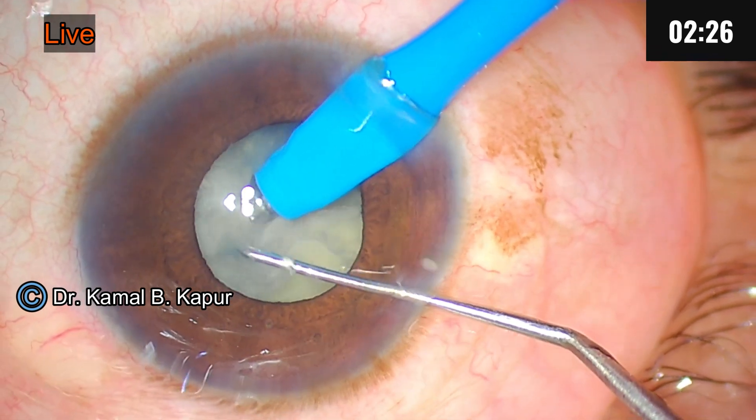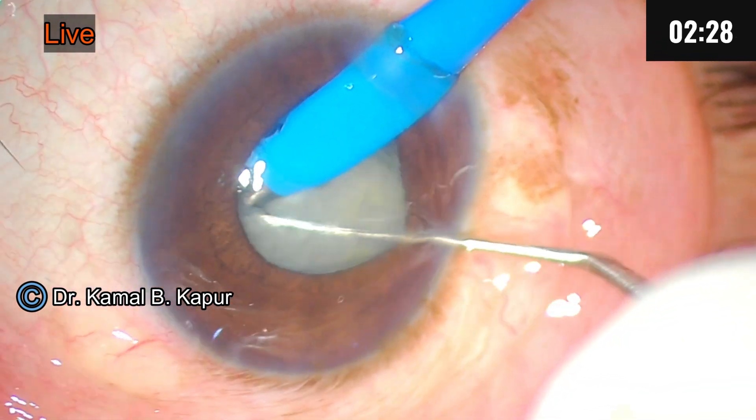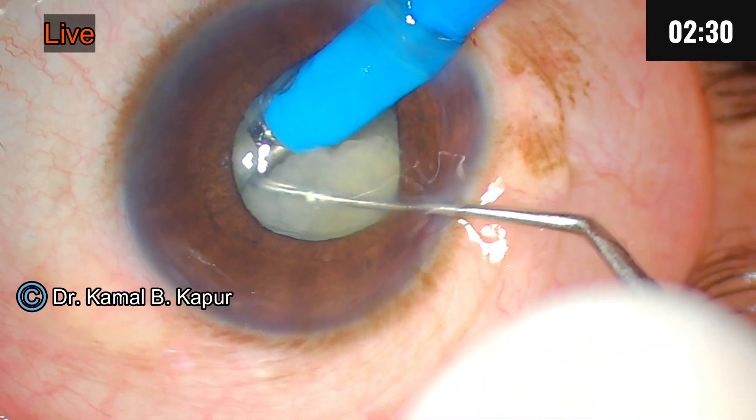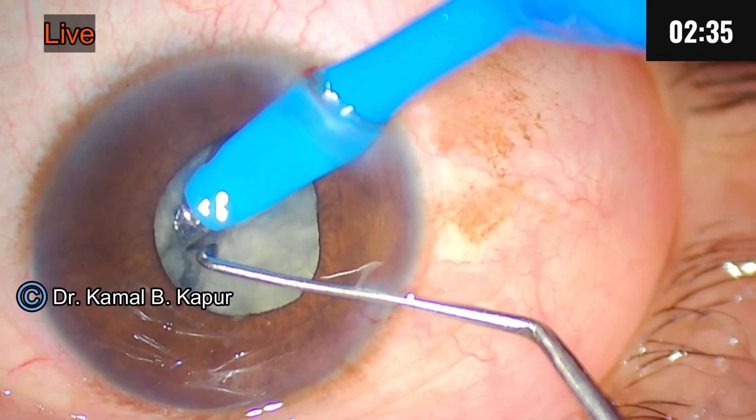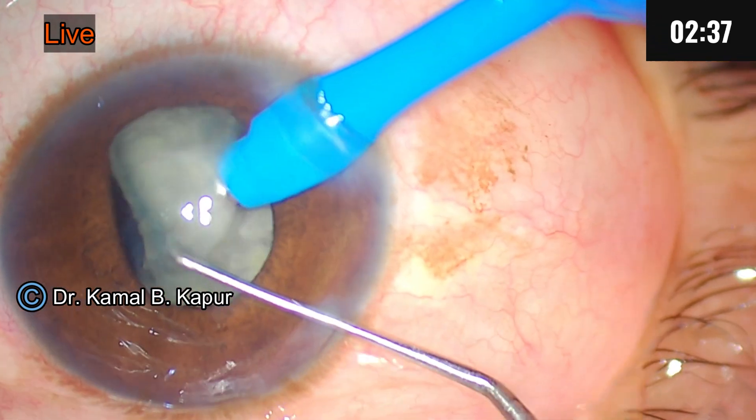The central core is not very hard and we are able to crack the cataract. When you are attempting to separate such cataracts, always be aware that there is a probability of complications.